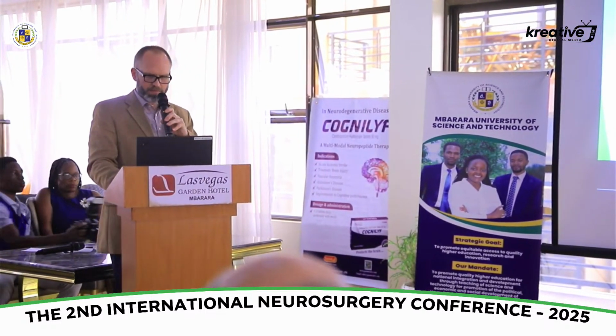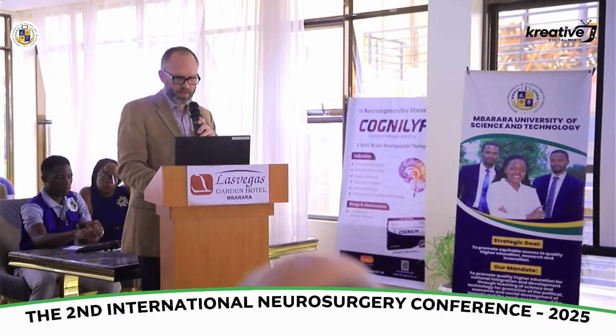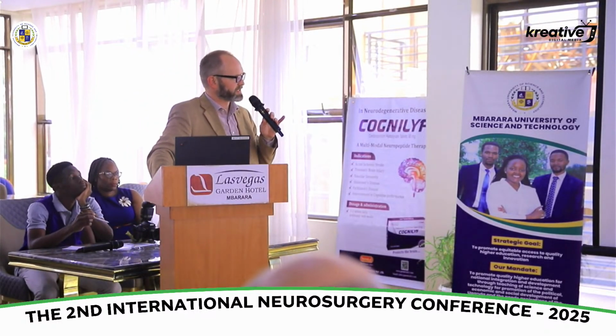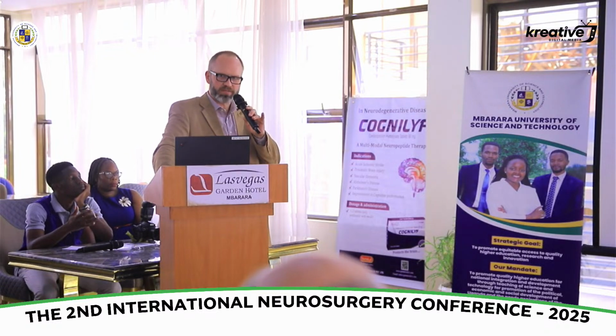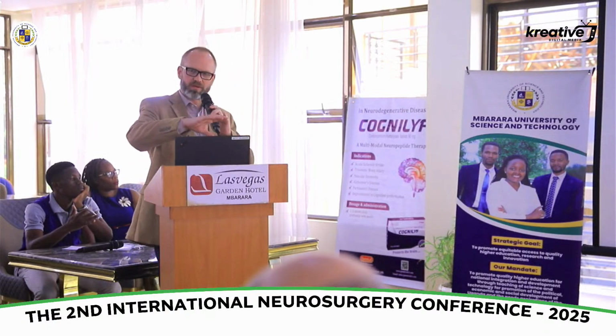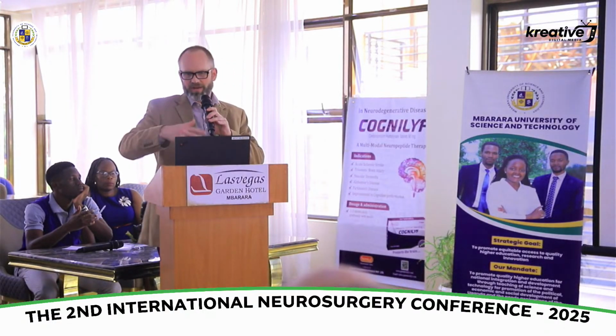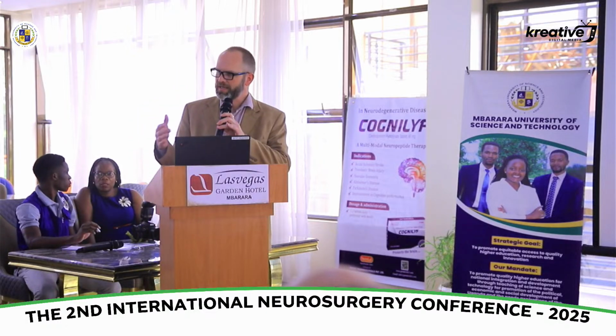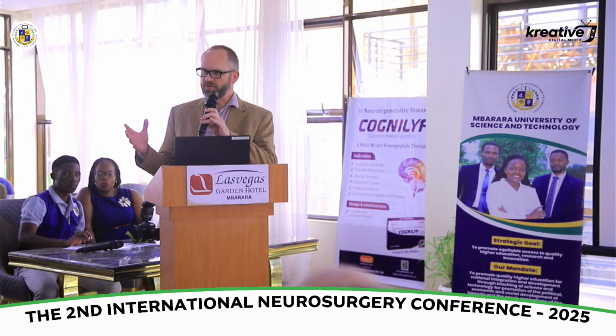It can be coupled with MRI, and even overlaid on navigation systems to help adjust for brain shift, which is kind of the bane of navigation systems. You have a preoperative CT or MRI, and then you do an operation, and in that operation the brain shifts, so none of it's accurate anymore.